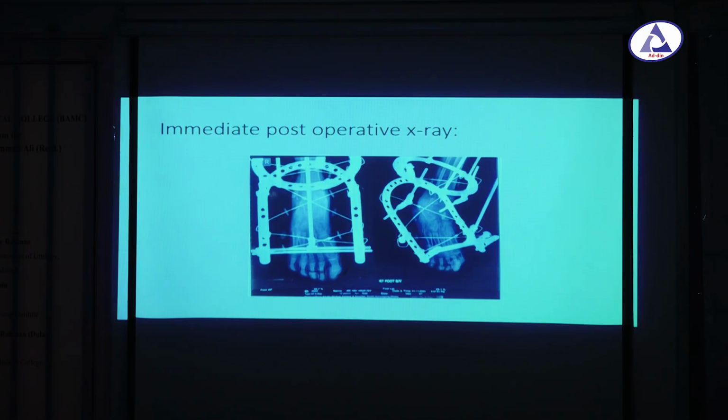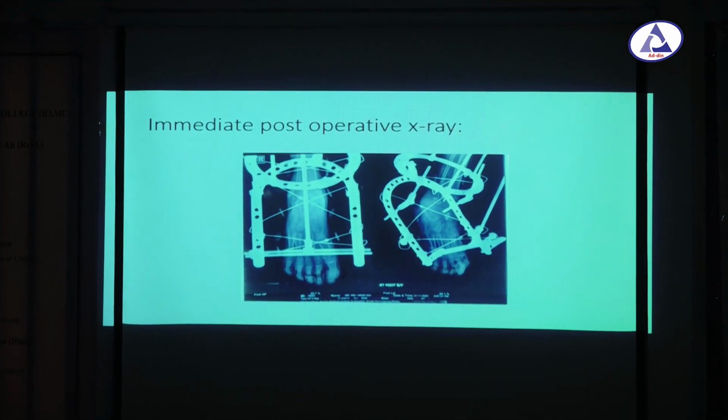And this is the view from the top, and this is the X-ray. So you can see all the apparatus is outside the limb, only these thin wires are inside the body. So actually this is less painful than doing surgery or an open procedure.